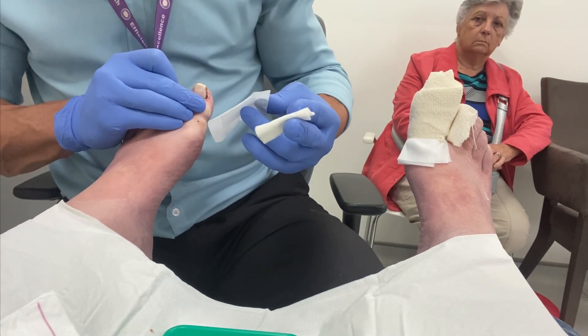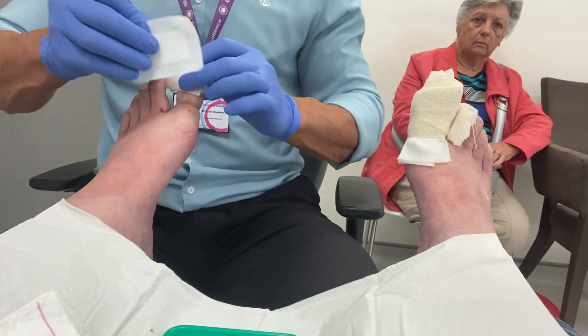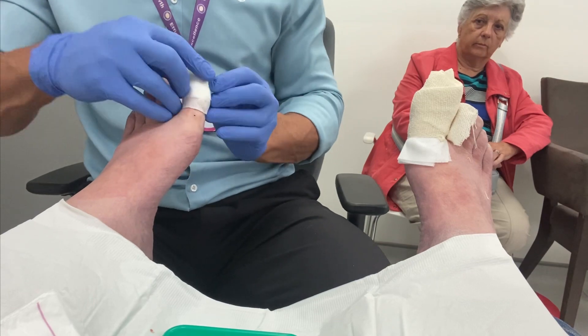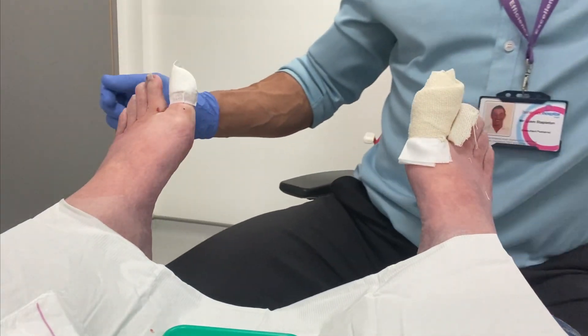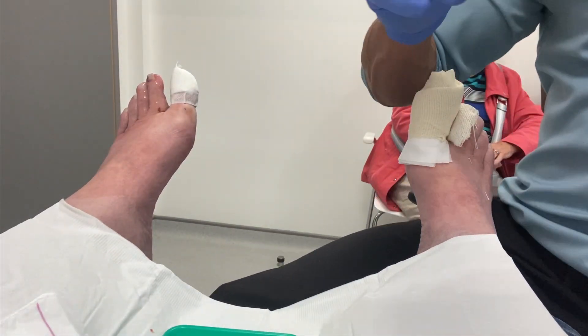We're waiting for the circulation to return to the tip of the digit before applying his dressing. And moving on to his second toe.